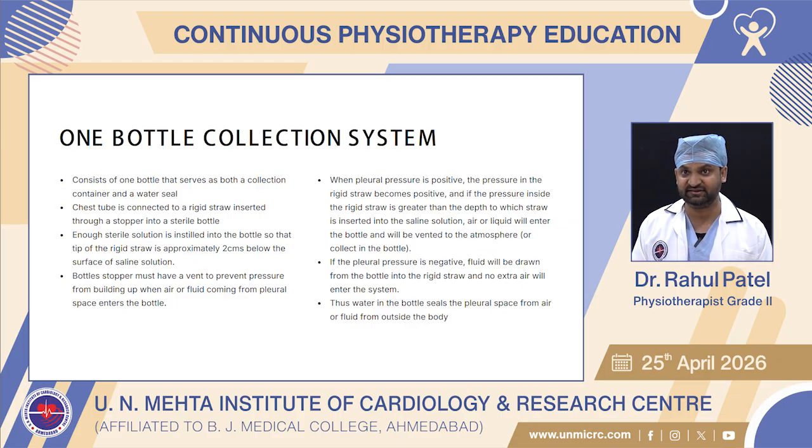When pleural pressure is positive, the pressure in the rigid straw becomes positive, and if pressure inside the rigid straw is greater than the depth to which the straw is inserted into the saline solution, air or liquid will enter the bottle and will be vented to the atmosphere or collected in the bottle.